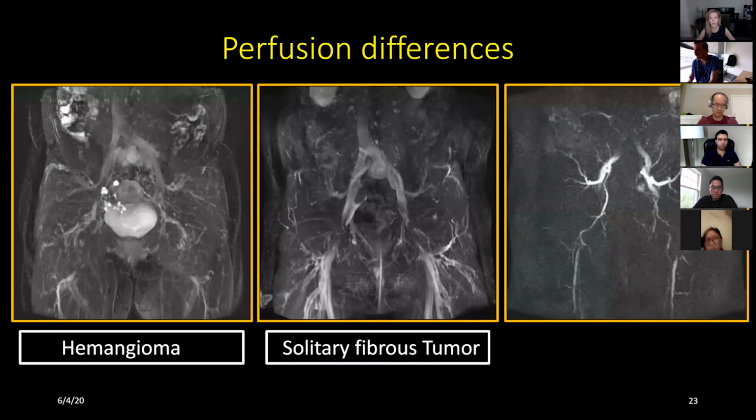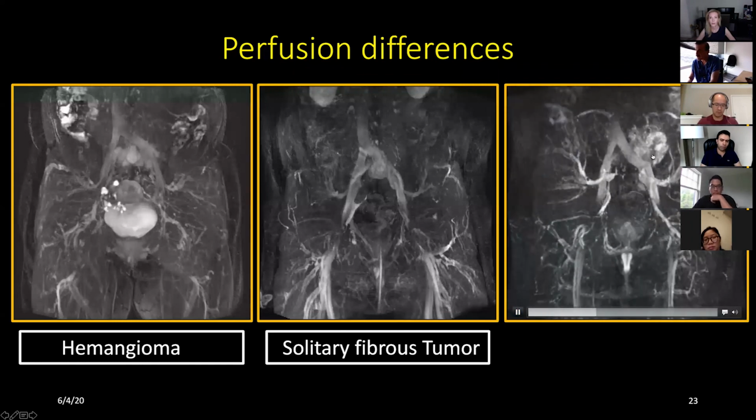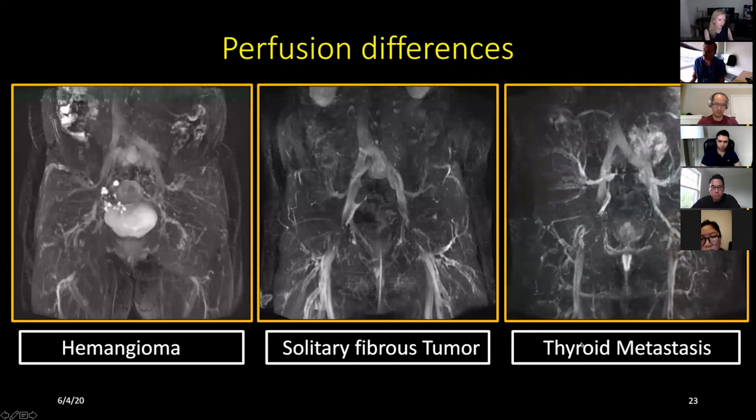And this is just to give you an idea about the third thing, which we normally see: something that enhances so much and keeps on that enhancement. And this is typical of metastatic disease. So again, work in progress, but hopefully we'll improve further with this type of imaging.